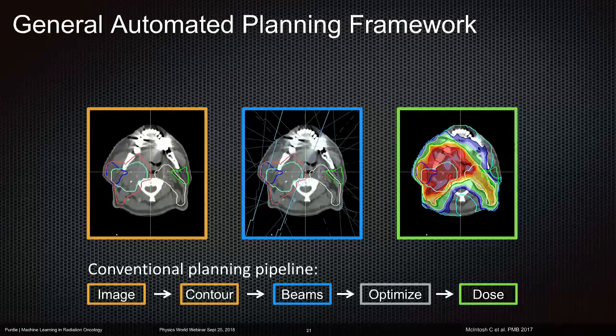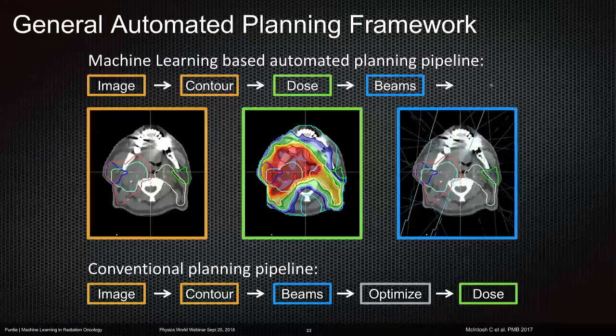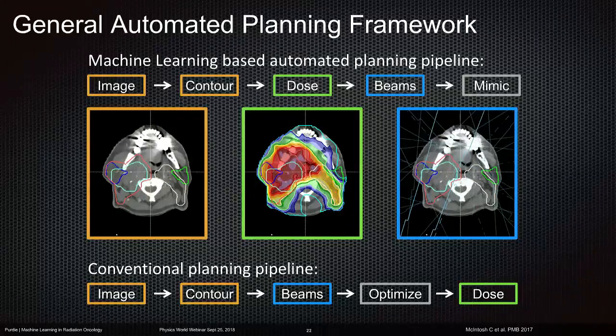So this is something that's really good for machine learning. You could almost think of the application of machine learning here as not doing a segmentation of a binary mask, like you're contouring a structure, but doing many, many segmentations on an image, which all represent different levels of dose. So what we do in the machine learning paradigm is we take an image, we still rely on contours.